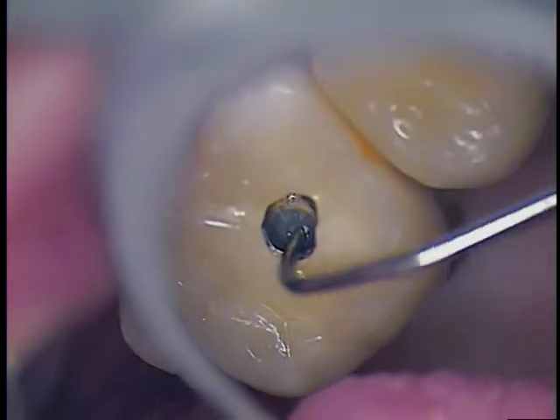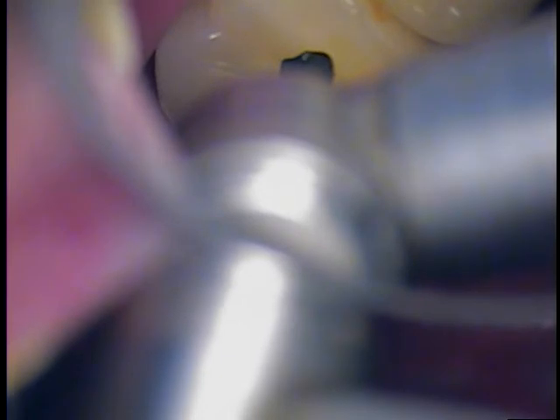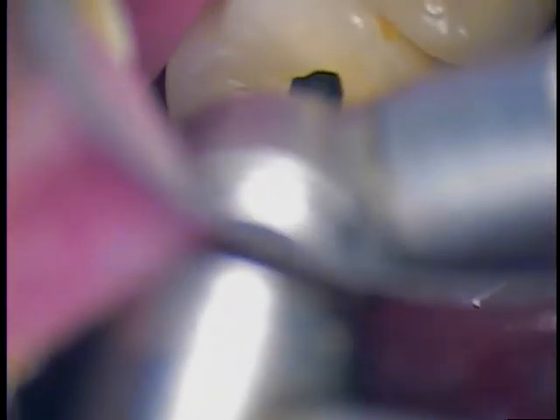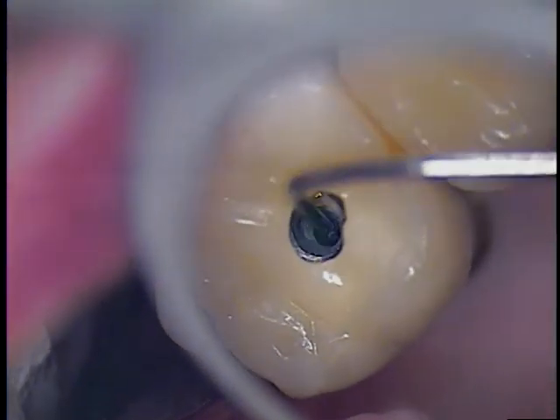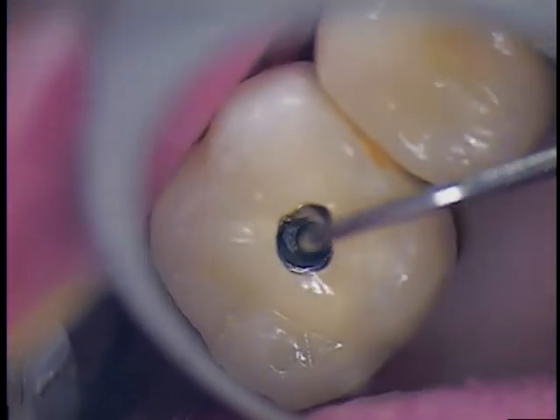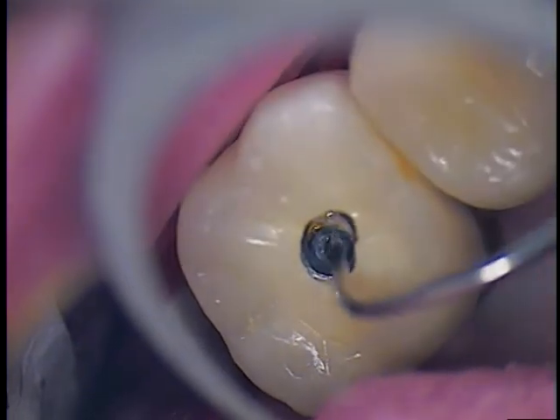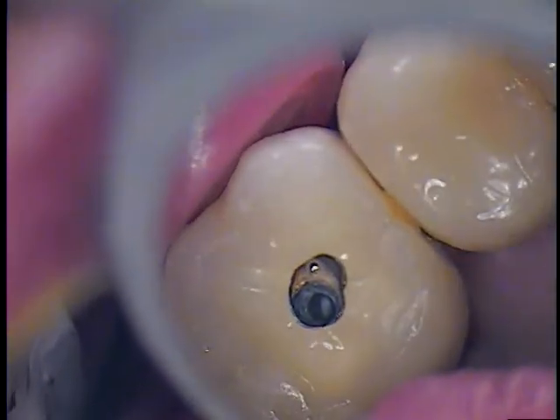There is a void, so it's good to assume that that's our chamber. And we're going to just de-roof it a little bit. We're drying that off and going back in there to get a feel of what's going on inside. Looks like there's a lot of this material internally, so that could mean a lot of hand instruments and working by hand.